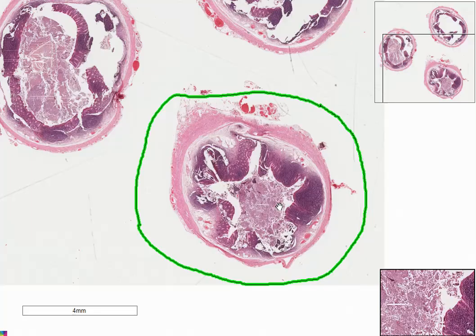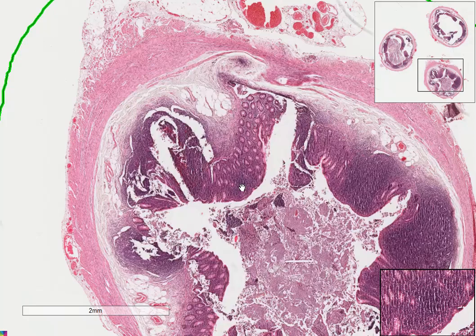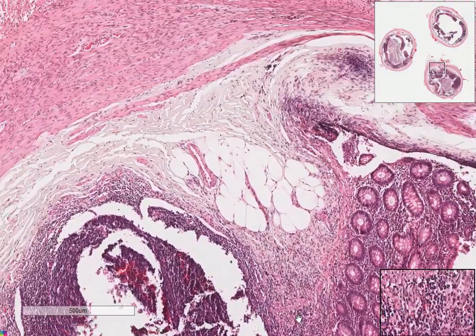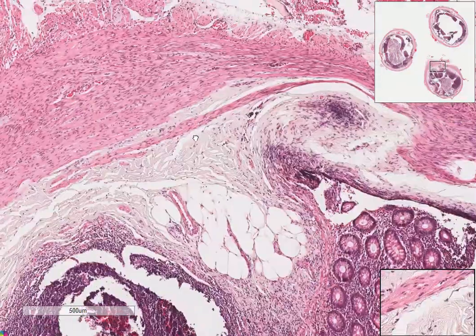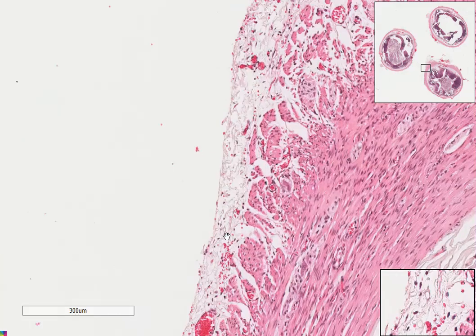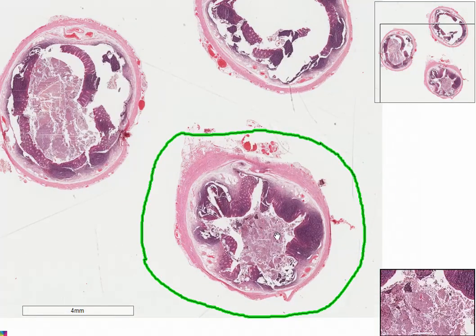But anyway, it's more common in children, which is when we get acute appendicitis, and histologically we usually tend to see neutrophils infiltrating into the muscularis, submucosa, mucosa, and even here getting all the way to the serosa here, where we get to call it peritonitis. But that's just a by the way of something to know about the appendix.